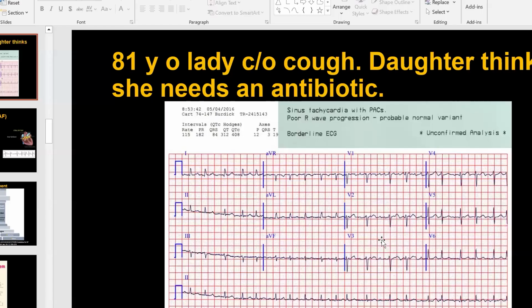Yeah, it's in that setting. Is this the one you're referring to? Oh, well, wait a minute. I have to share my screen. I'm not doing it. Well, all right. Let me. Is this the one you're referring to?